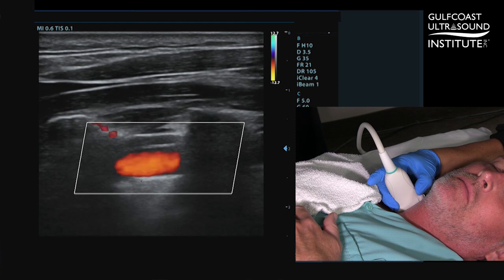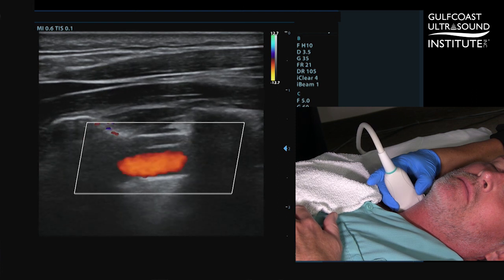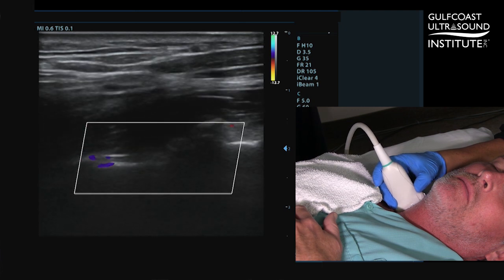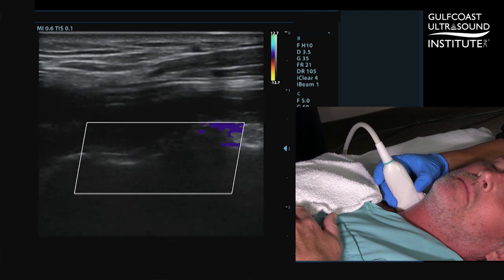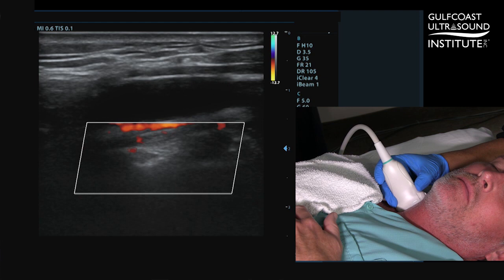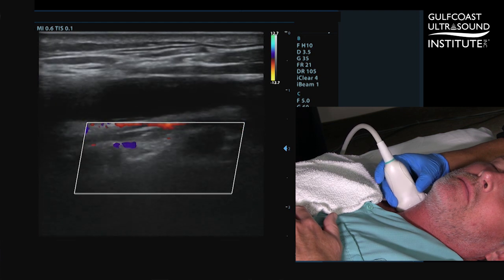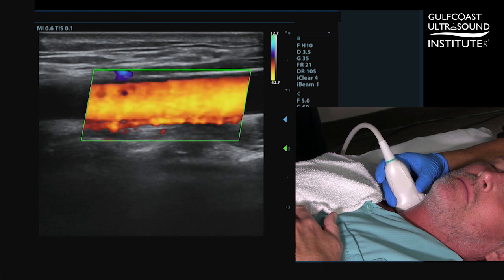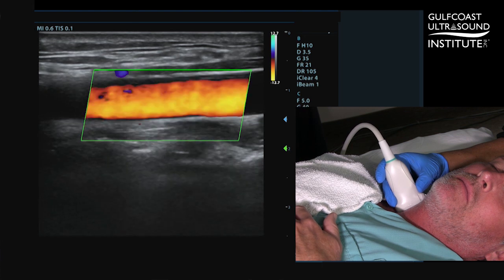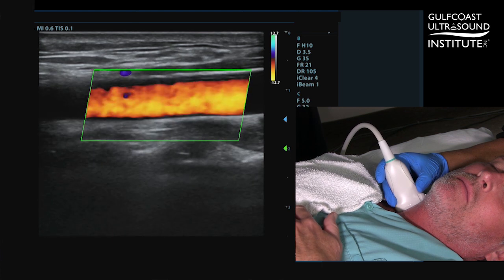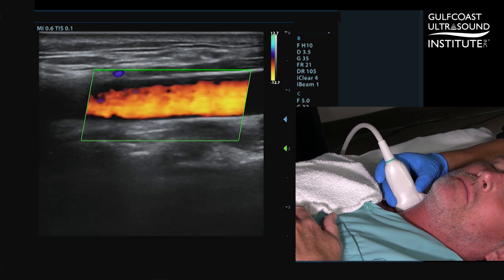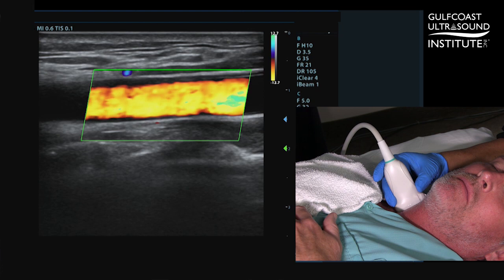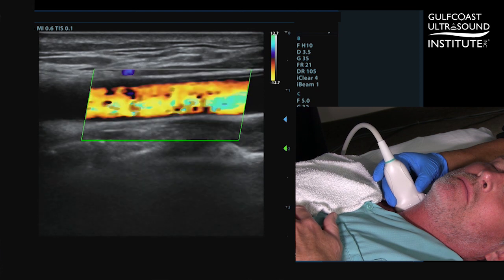To validate that flow is going in the appropriate direction, angle your sound beam back up into the common carotid artery. Reposition your color box into the common carotid artery and you'll notice the color is the same in the common carotid artery as it was in the vertebral artery. This indicates antegrade flow — flow towards the head — and is an example of normal flow.